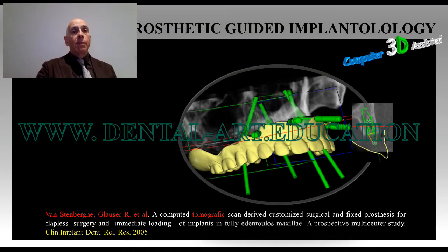Today, we use this procedure, which we have defined as prosthetically guided 3D computer-assisted implantology. We have understood that this is a system in which the surgical template, produced following the software planning indications, puts in relation the anatomy of the patient with the prosthesis prepared before surgery, with safety and predictability.